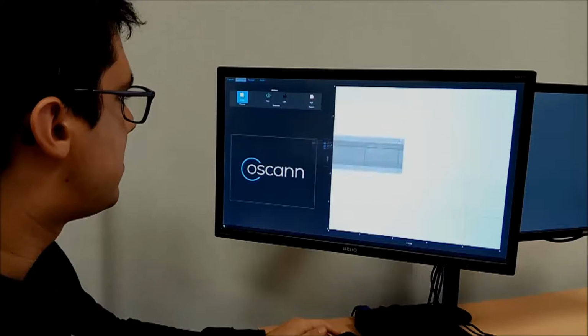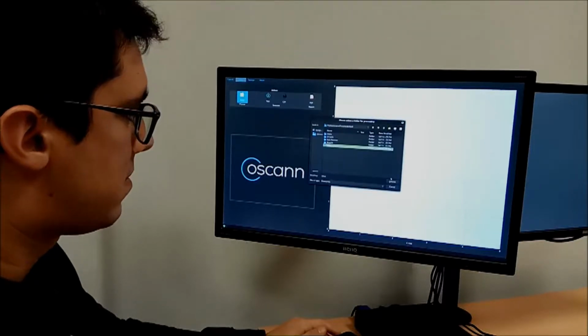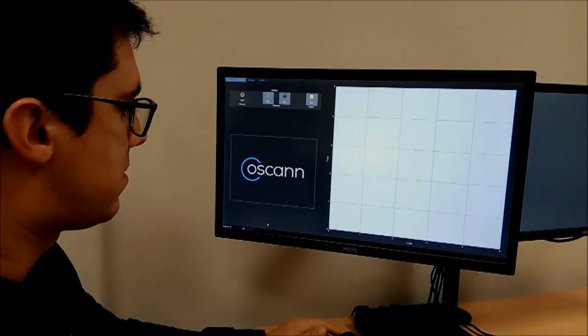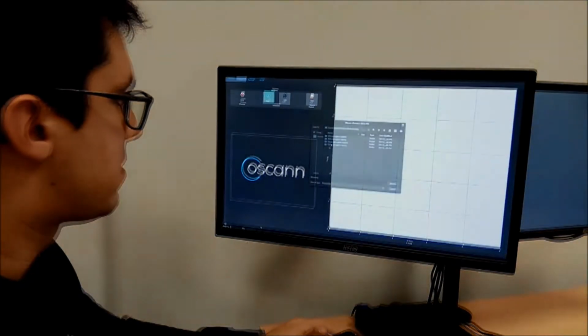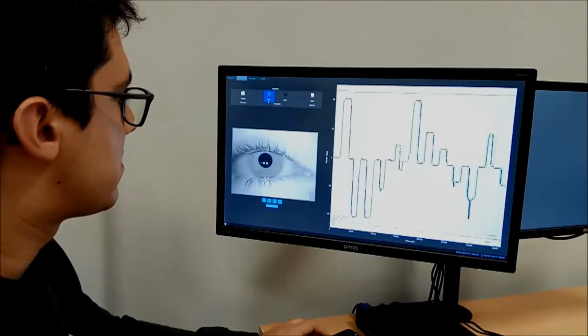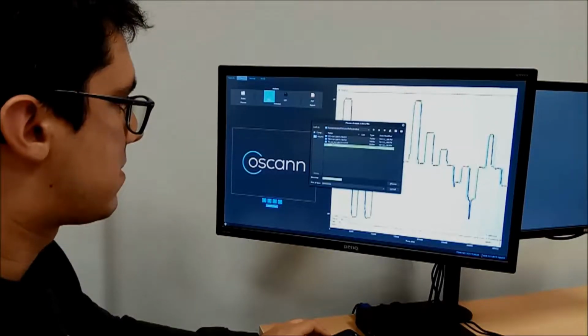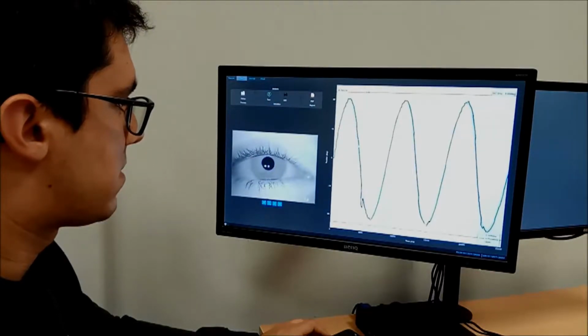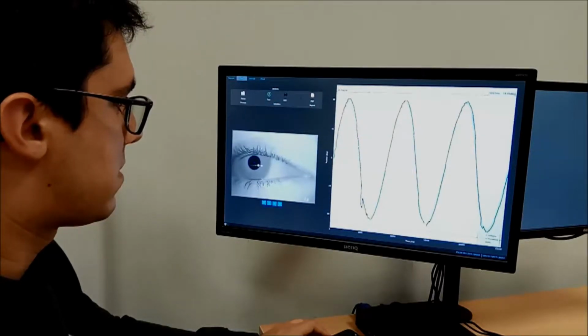The software interface is intuitive. It allows you to process the test with a single push of a button, and in less than 5 minutes the results can be obtained. After the tests are processed, the interface shows the graphs of the movement of the eye. There are different visualization modes especially adapted to each type of test.